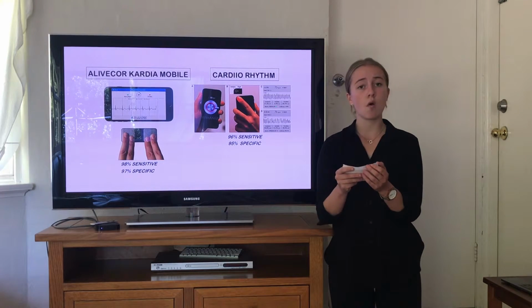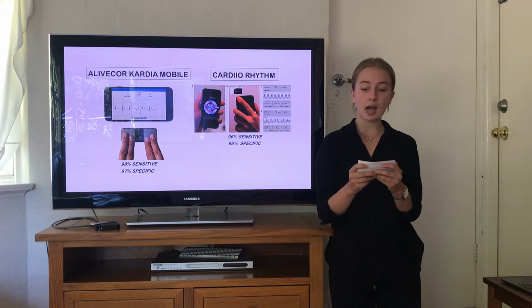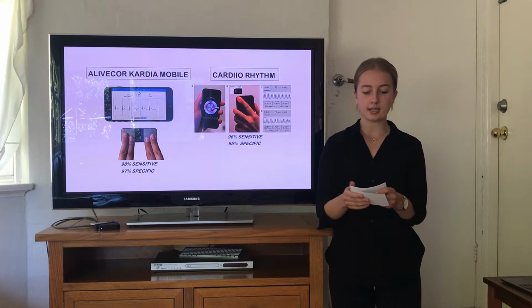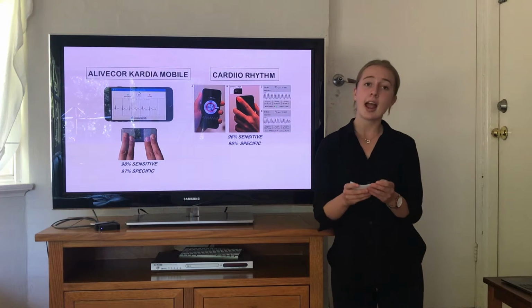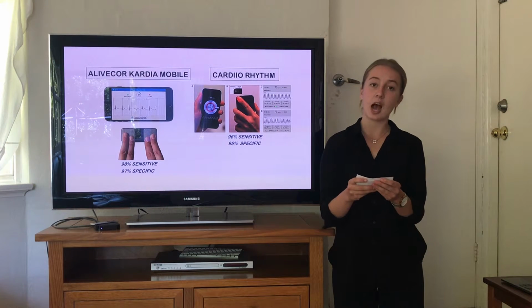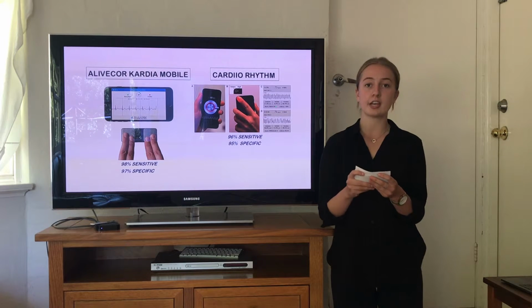In 2012, AliveCor developed the first smartphone-connected ECG app known as KardiaMobile. With the credit card-sized electrodes snapped onto the back of their phone, users place 2 fingers directly over the sensors, allowing electrical impulses from the fingertips to be collected and converted into ultrasound signals and then into an ECG. Clinical trials have found the KardiaMobile ECGs to be 98% sensitive and 97% specific in diagnosing atrial fibrillation.